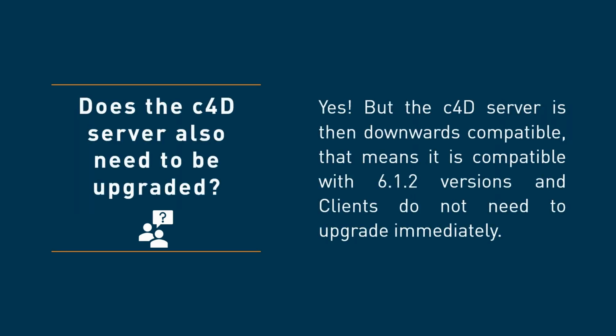Does the c4D server also need to be upgraded? Yes, the current c4D server version is also 613 Service Pack 1. The big advantage here is that it will be backwards compatible. That means that the server can be upgraded to 613, but the clients for Catalyst, Sentinel or Office can remain on, for instance, 612 and it's not a must to upgrade. However, it's not possible the other way around, of course, to leave the server on 612.